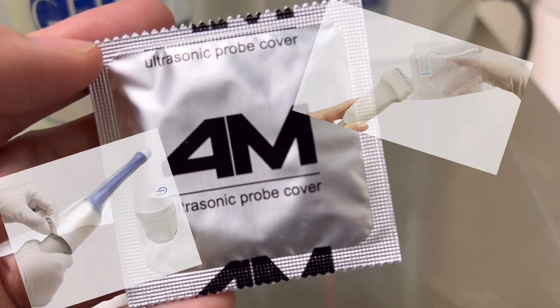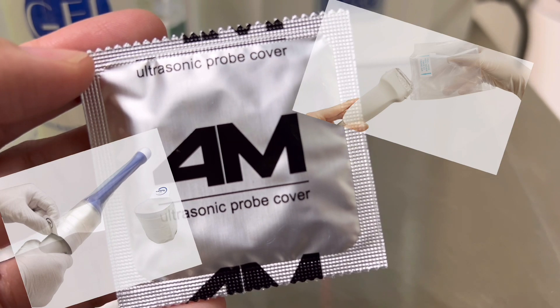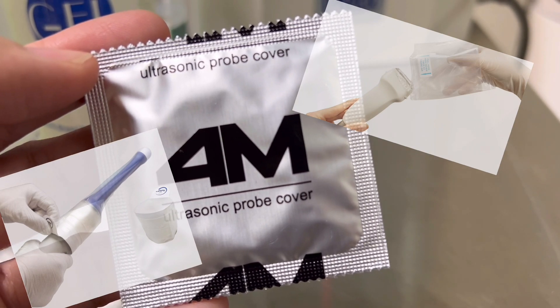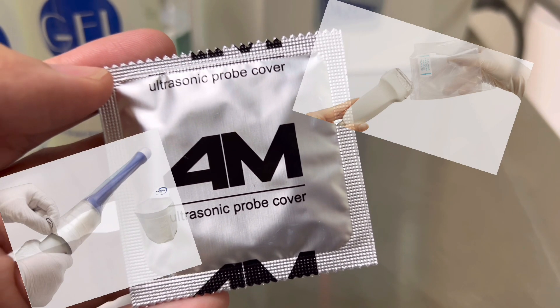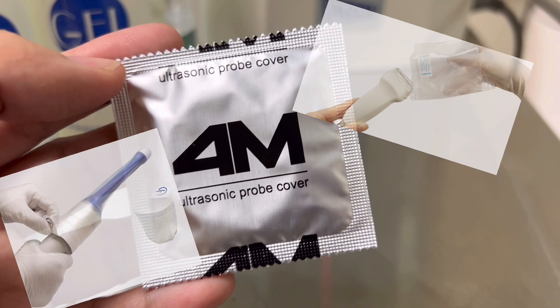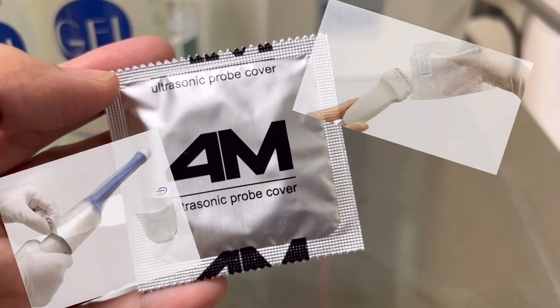General purpose probe coverings are utilized to safeguard linear and curved transducers. Simply said, probe covers protect your equipment from bodily fluids and lower the danger of hospital acquired infections.